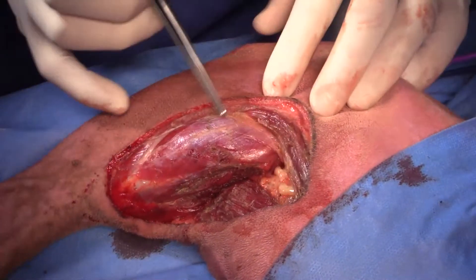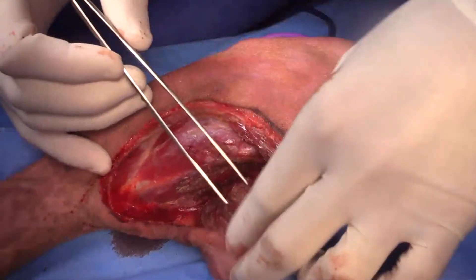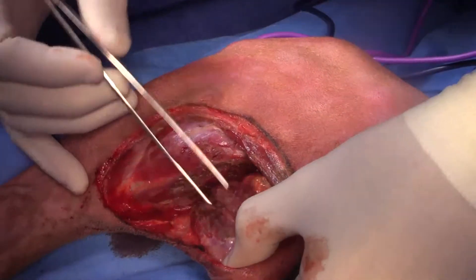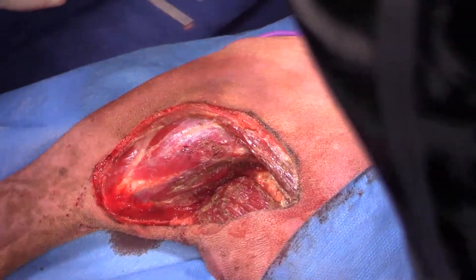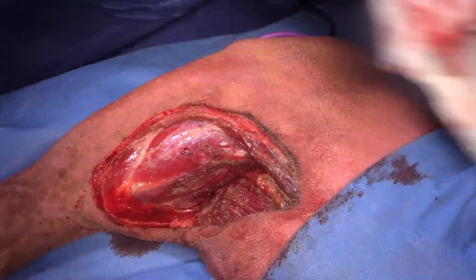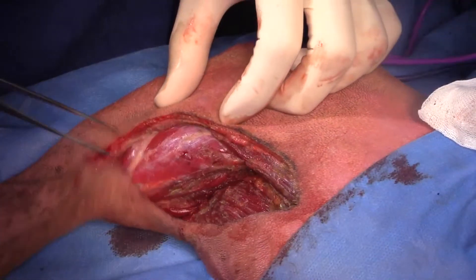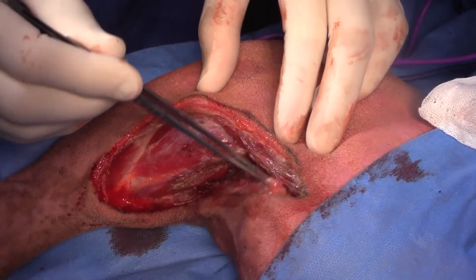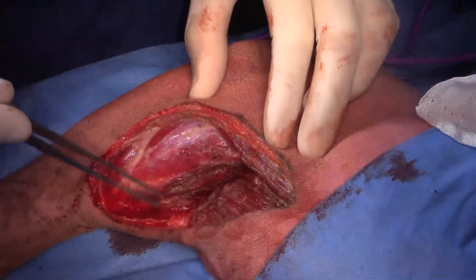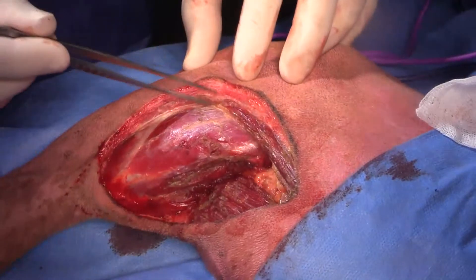Just to review: gastroc there, biceps muscle there, sciatic nerve there. I think this is probably semitendinosus right here, and we've taken a bit of the fascia on that as well. And this will close really nicely. We'll close the muscle together first, across like this, over the top there to that muscle fascia — that's fascia latae right there.